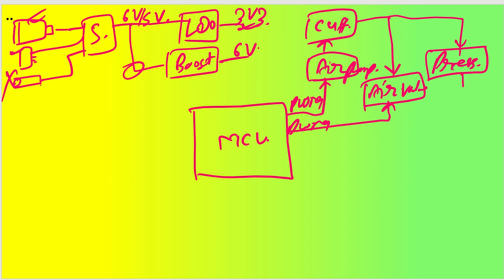But right now we'll put it through the signal conditioning circuit, where we'll try to filter the output as well as utilize some of the instrumentation amplifier, amplification and everything, and we will have NIBP ranges also. So for that we'll send it to ADCs. So this is how we have designed the pressure sensor control technology also.